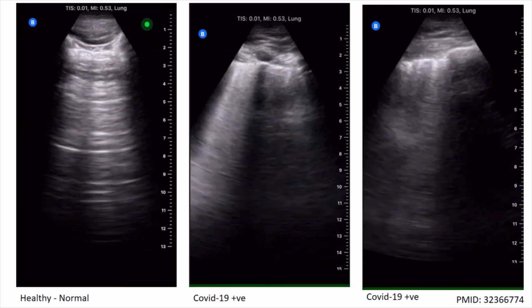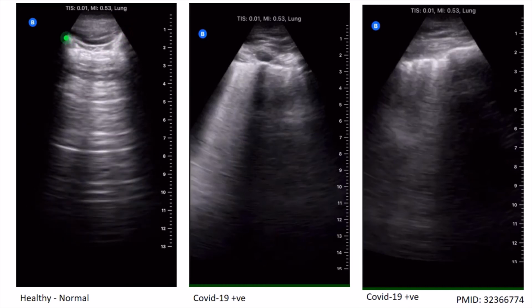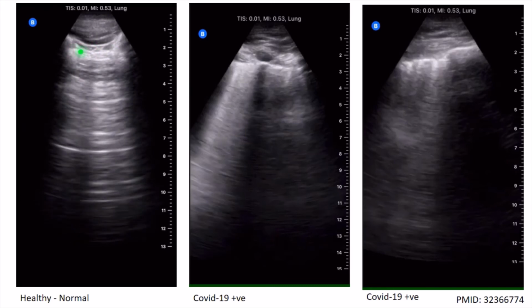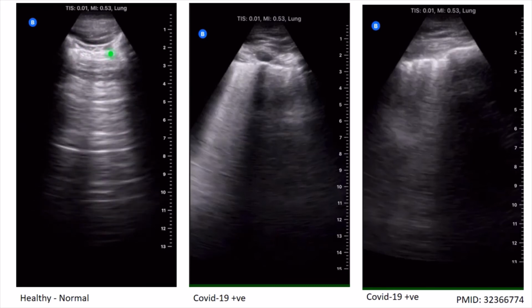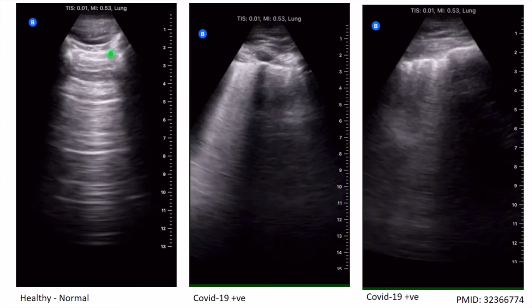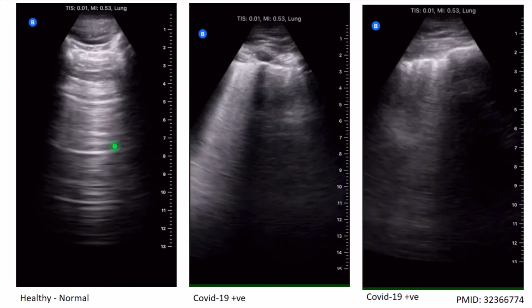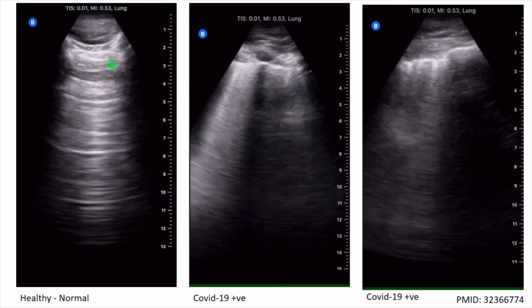This is a lung ultrasound. We are in a lung preset. We have a rib and shadow, an adjacent rib and shadow, a nice thin pleural line with nice continuity, and left and right sliding, indicating the absence of a pneumothorax at this level. We see regularly spaced hyperechoic bright horizontal lines, which are A lines. These indicate reverberation artifact from a normal air-filled lung.